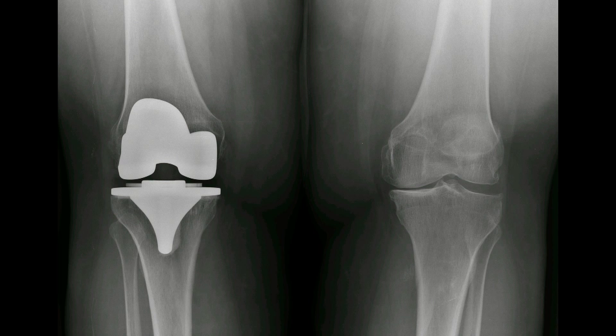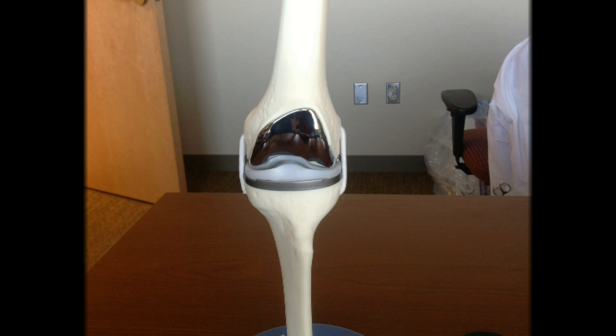Knee osteoarthritis can be painful and disabling. It is a very common condition that occurs as a result of wear and tear on the cartilage padding in the knee. Knee replacement surgery involves replacing the worn out joint surfaces with metal implants. Usually the implants include a femoral component, a tibial component, and a patellar component.